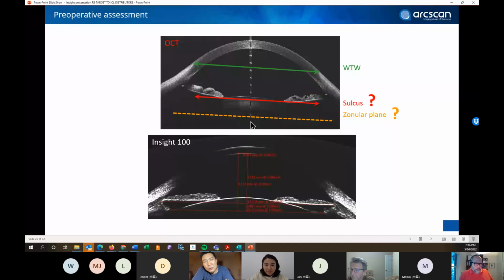Sometimes we don't. What's the reason? Do you remember that I said about the red line, the focus line? When the focus line is towards the back, we are focused on this area. This is where we need to focus.